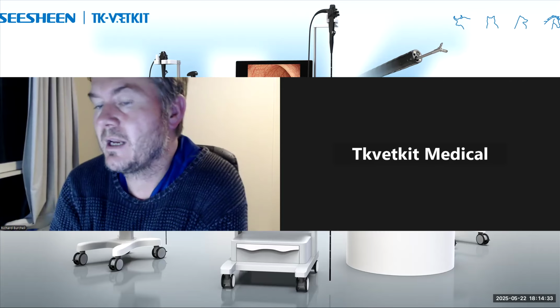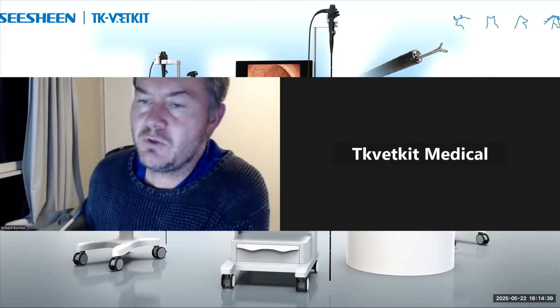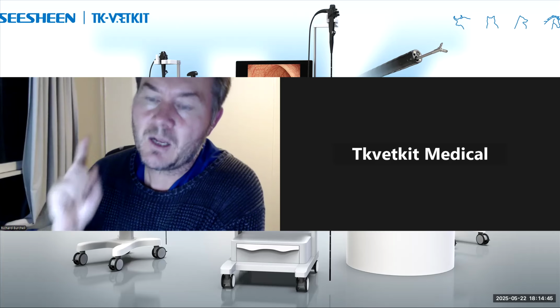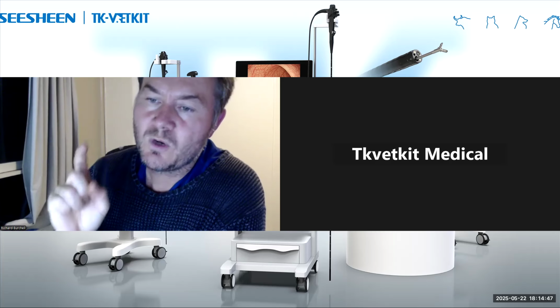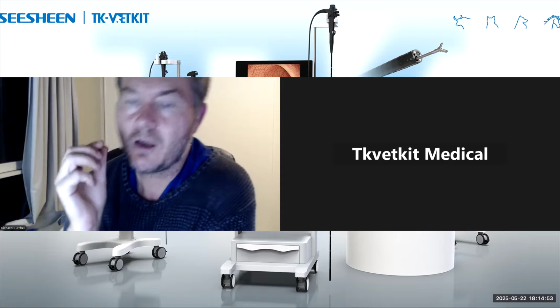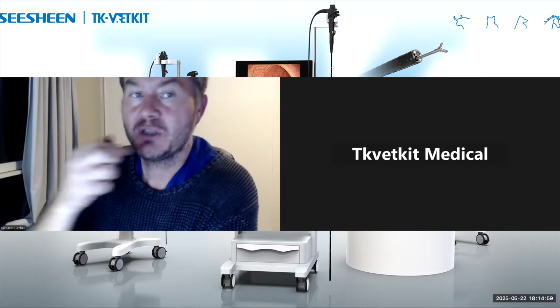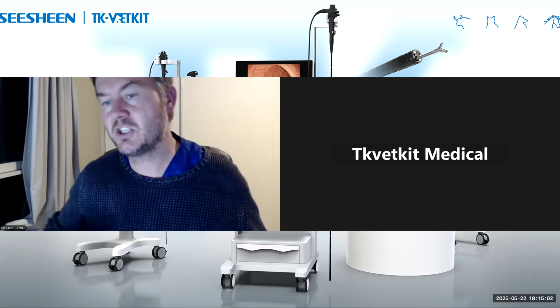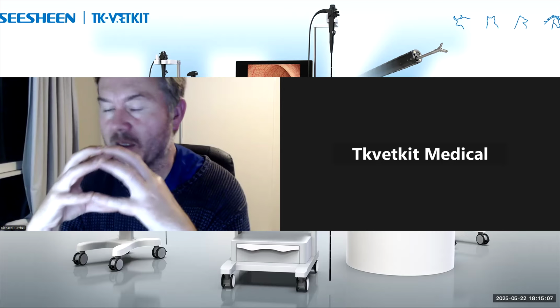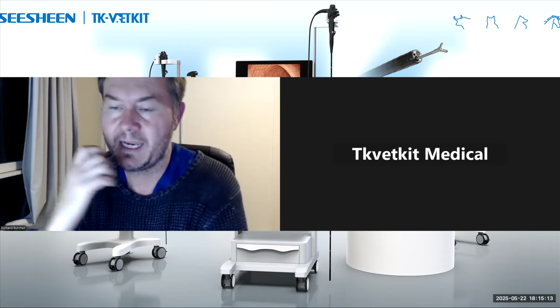Yes, you can. I don't generally get them with rhinoscopy, but I do get them with biopsies. What I tend to do if I get a bleed is I'll pack gauze swabs into the back of the nasopharynx, into the choana, to occlude the nose at the back, and then I'll often put swabs or Q-tips into the nasal passages, so that you've essentially confined the bleeding into the nasal vault. In theory, if you can occlude it from both sides, it can't bleed beyond that.